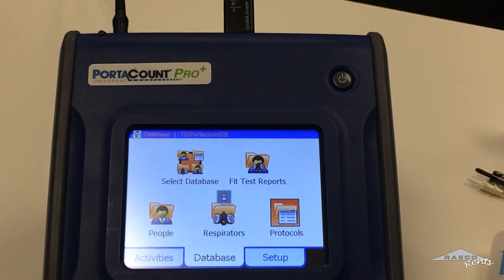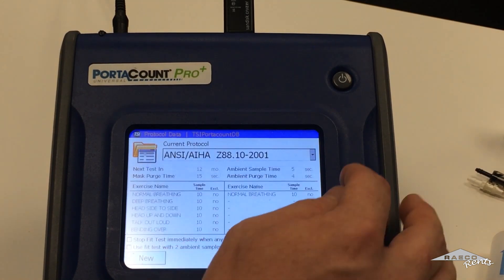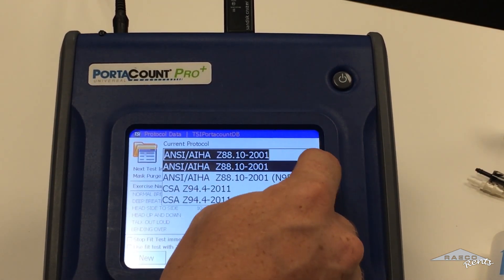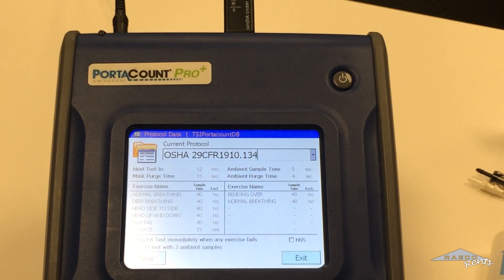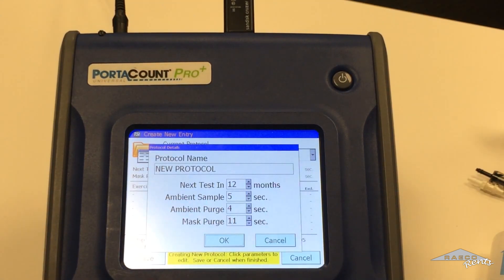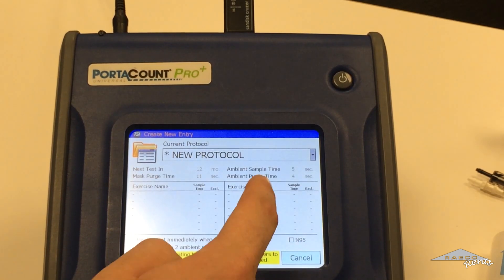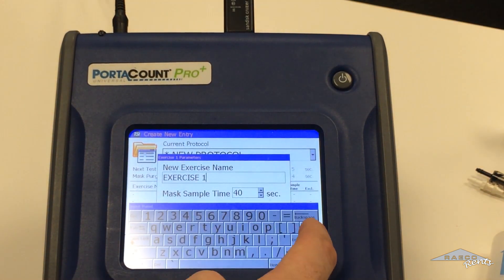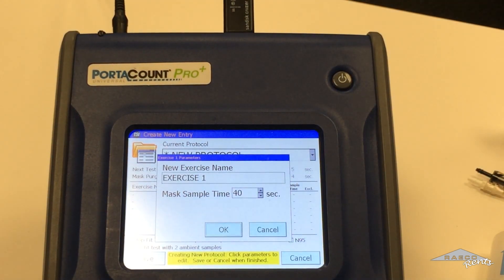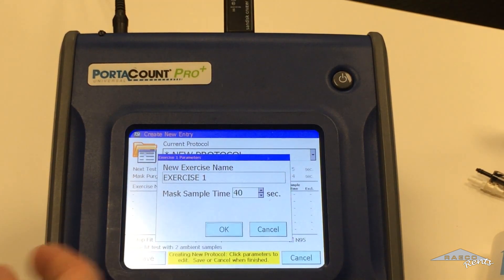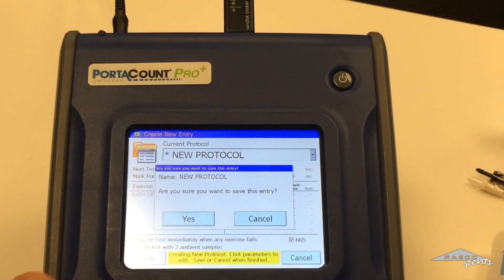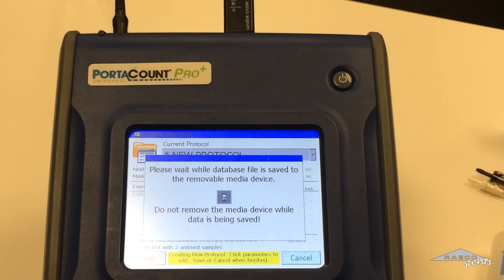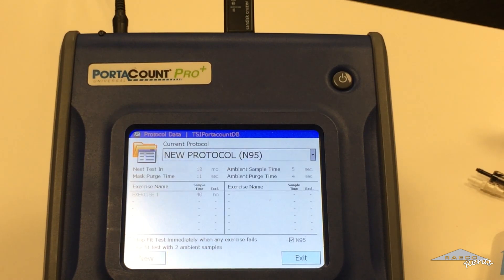The last thing we're doing to set up the database is the protocol. We're going to select the OSHA protocol right away. We've got OSHA selected, so we're going to hit new. You can name it if you want — we'll just leave it as is. We need to pick an exercise first; we'll go with exercise one. Typically people will do things like turning your head or a grimace for the mask fit. Hit OK, and if you're doing N95, again make sure you check that box. Then save it. That is setting up your database.